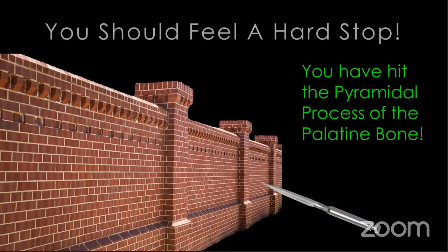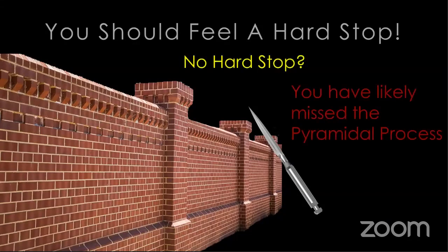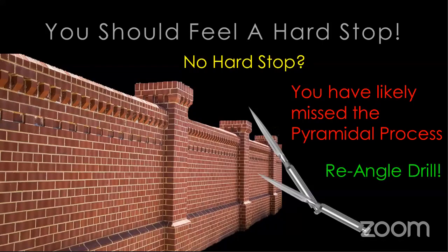So if you're placing your osteotome or your sharp spade drill and you don't hear that change in frequency, you don't feel that difference in the way that it engages the bone, then more than likely you're too lateral. What you need to do is re-angulate your drill, typically more medially, to engage that denser bone. And it's almost always more medially. In most cases, you're too lateral if you're not getting that dense, hard feeling.